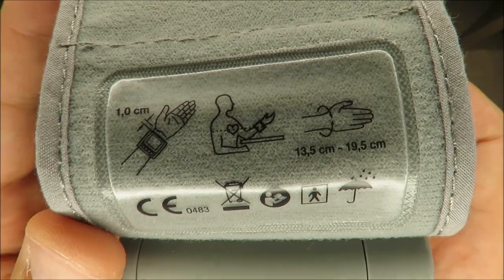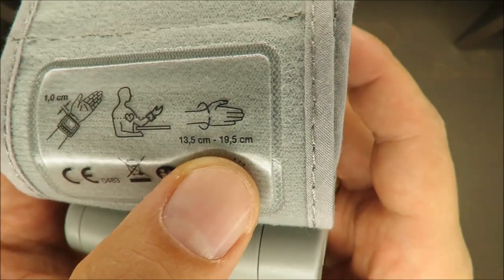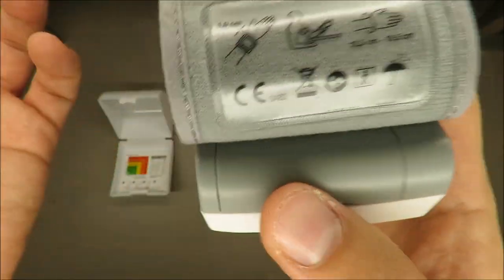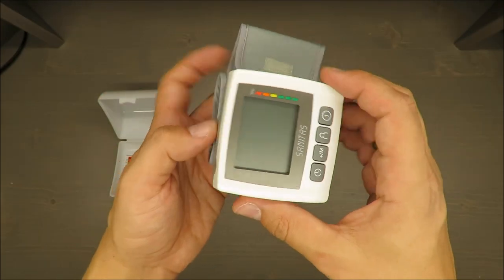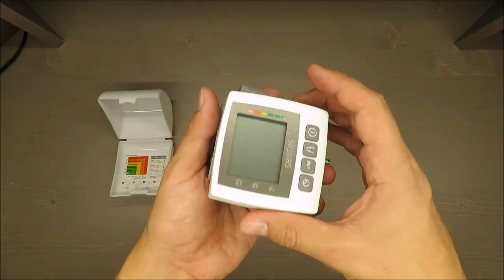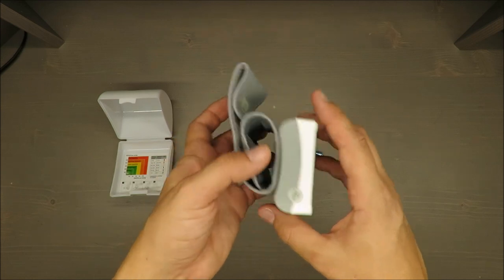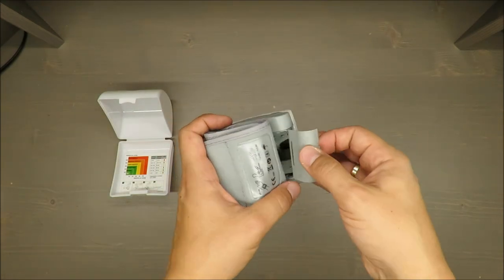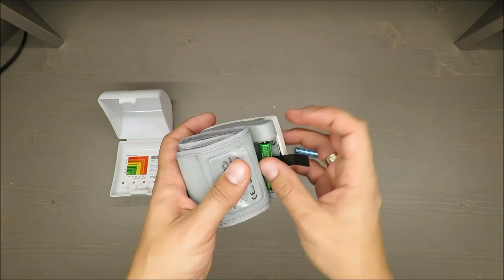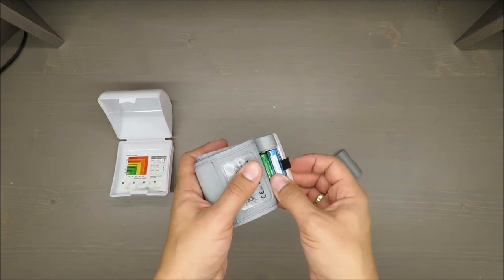The second feature is the dimension of this hose — up to almost 20 centimeters. It has memory for up to two times 60 measurements. It automatically turns off, so power management is okay. It can also calculate an average out of your measurements.